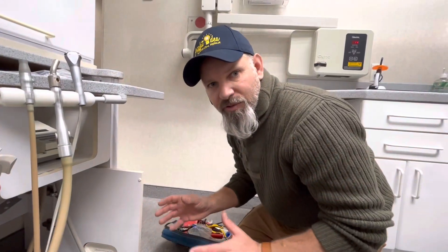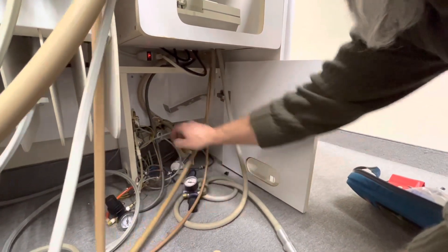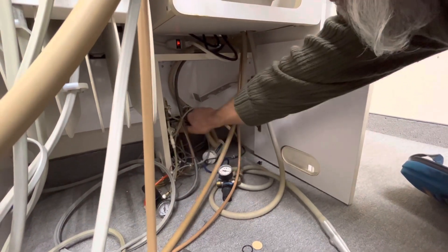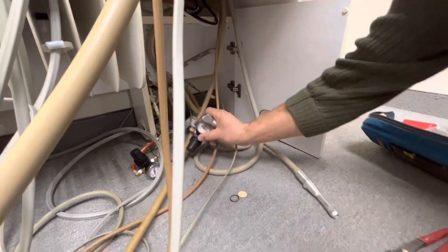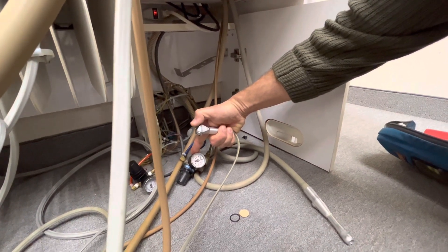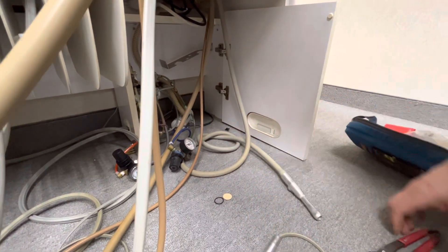Step one of doing this repair is to go ahead and turn off the water. In a dental unit like this, wherever this is hooked to, there's going to be a valve and I'm going to turn that valve off. That's going to shut it off. Now when I push this button, the pressure is going to go down and it's not going to come back. Step one whenever you work on a water system is to make sure you can't get any water out — that tells you the system is not pressurized.